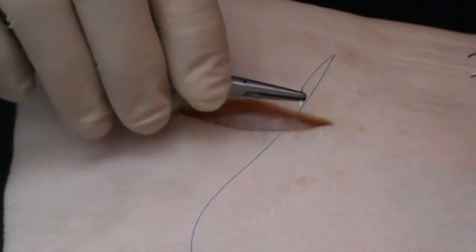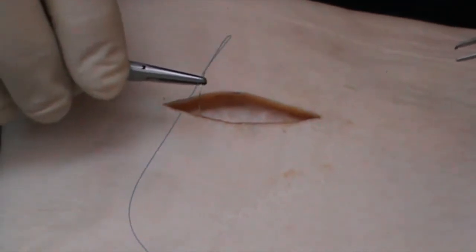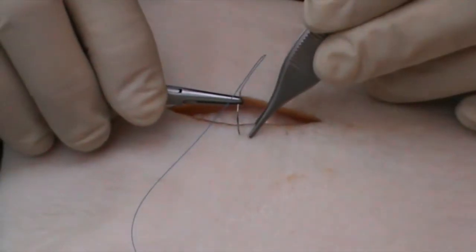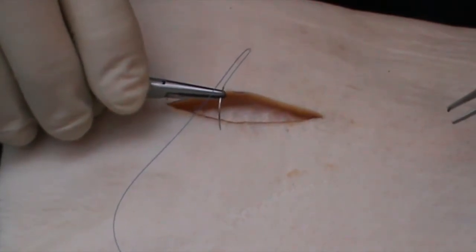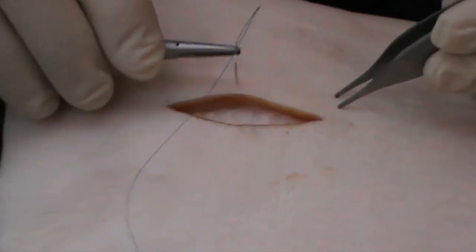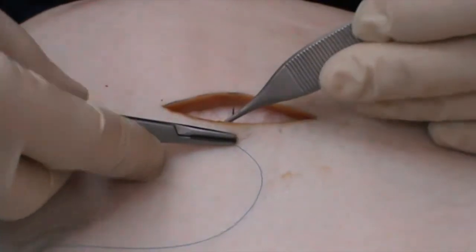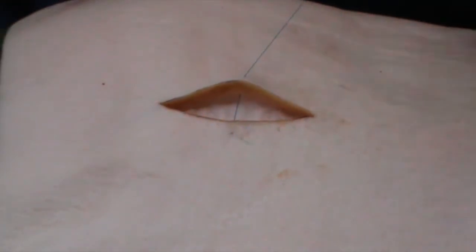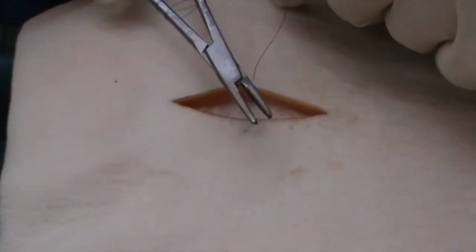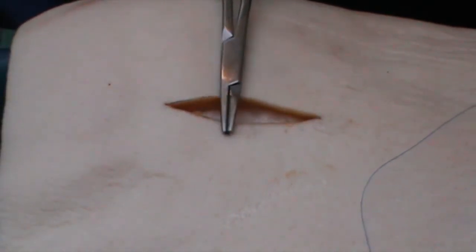Earlier I showed how to insert the sutures starting at one apex and working your way along. A lot of hospital wounds are closed by starting in the centre and then working out. That's fine if all you have is a surgical cut in the skin. However, we have taken tissue away. Therefore, the area with the greatest tension is here in the centre. If we try to follow that approach — which is not the correct approach for skin surgery to close an ellipse — you'll find that the amount of tension required to bring this together is much more likely to cause the stitch to break. Which is why we always start at one apex and work our way along.